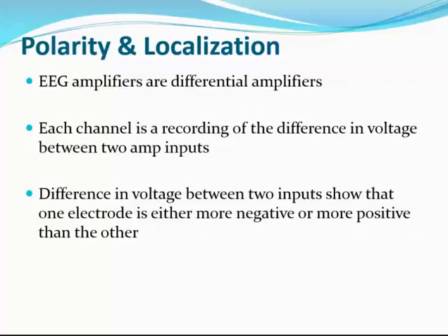Those assumptions are being made in this lecture. If you do not have that, you can just refer to any basic EEG text, where you will find what we call the 10-20 positions. This way we can speak the same language.